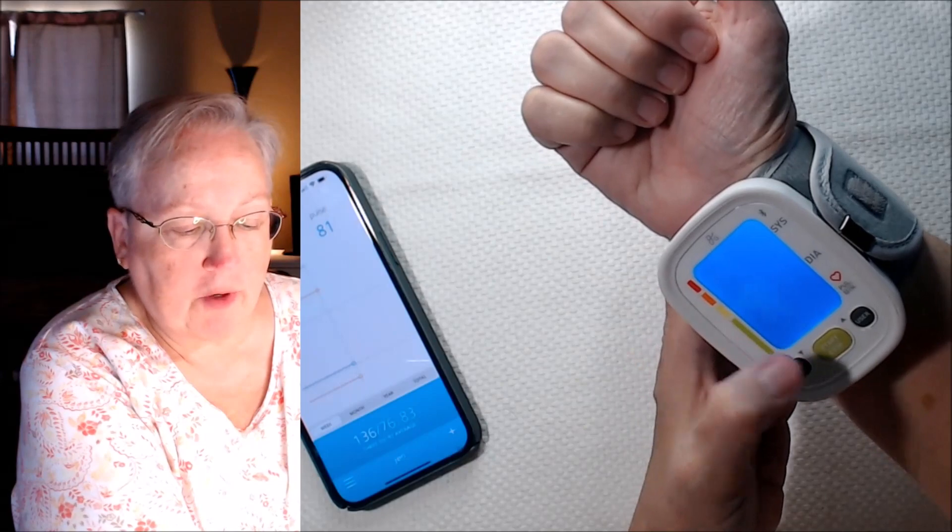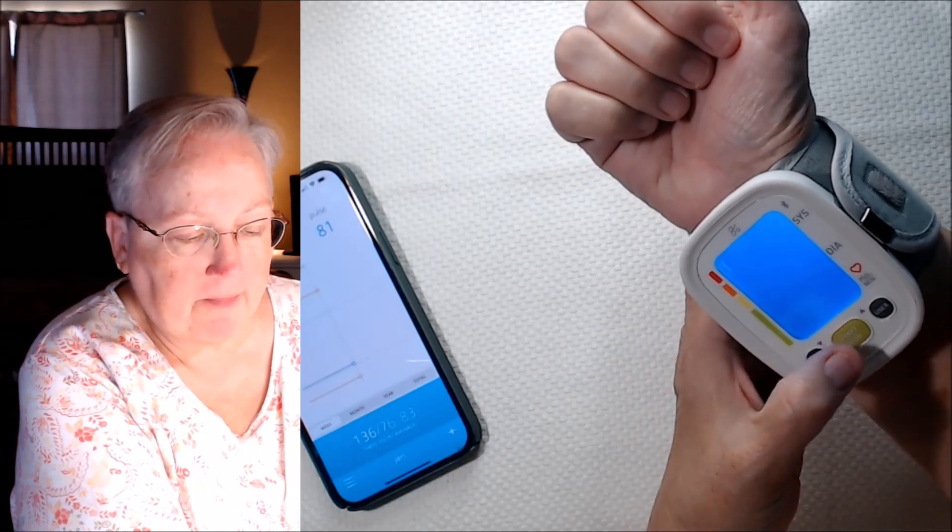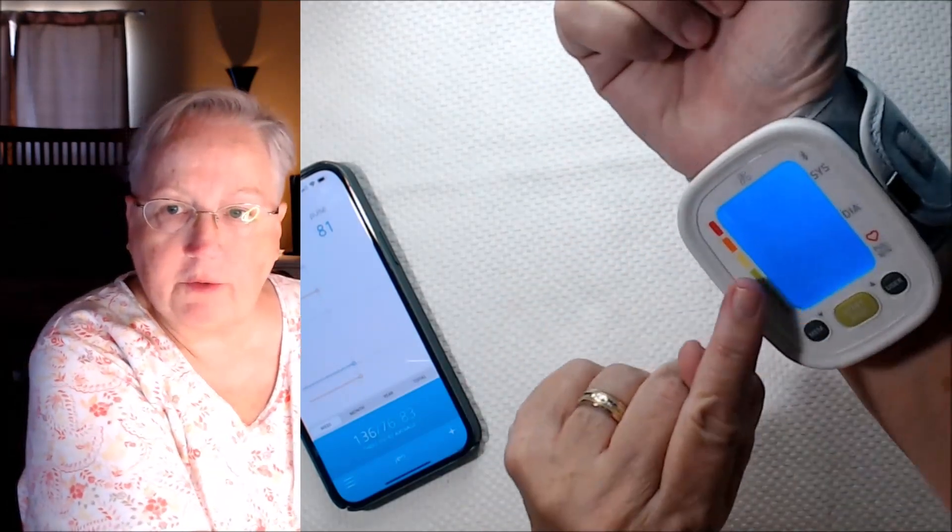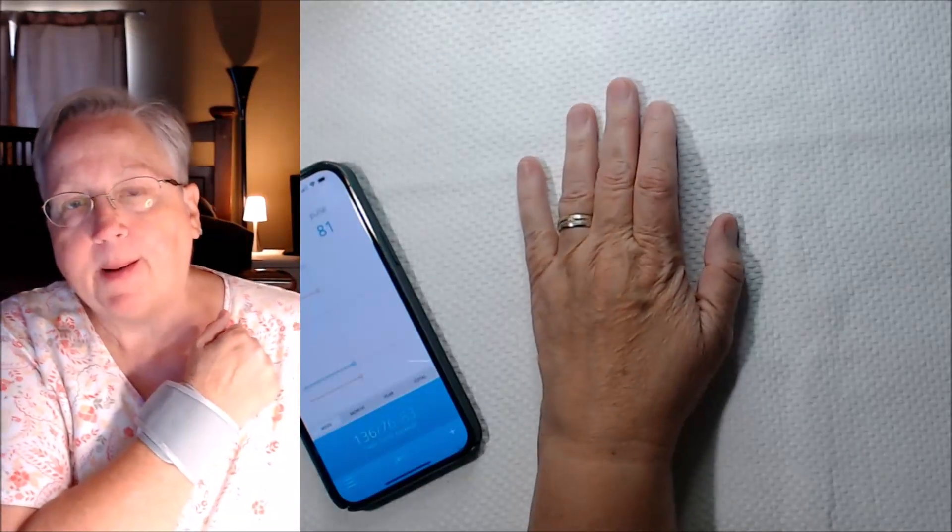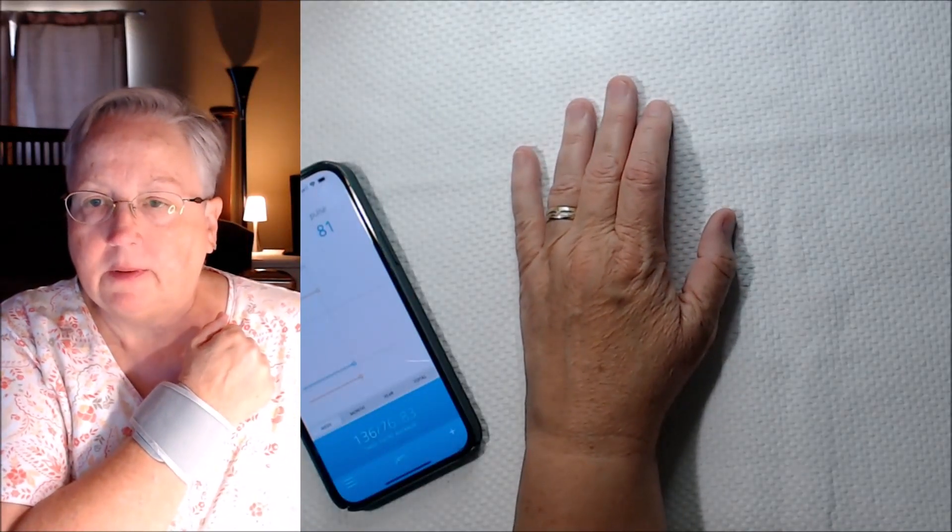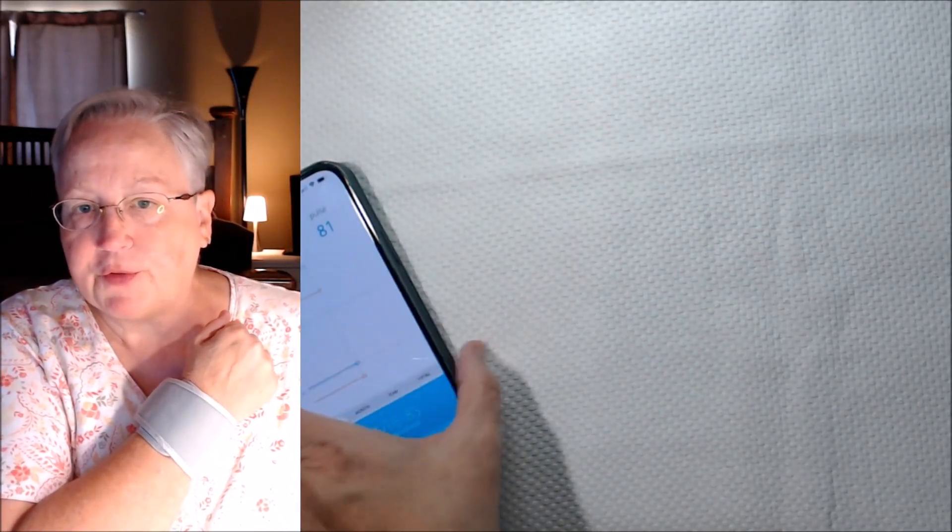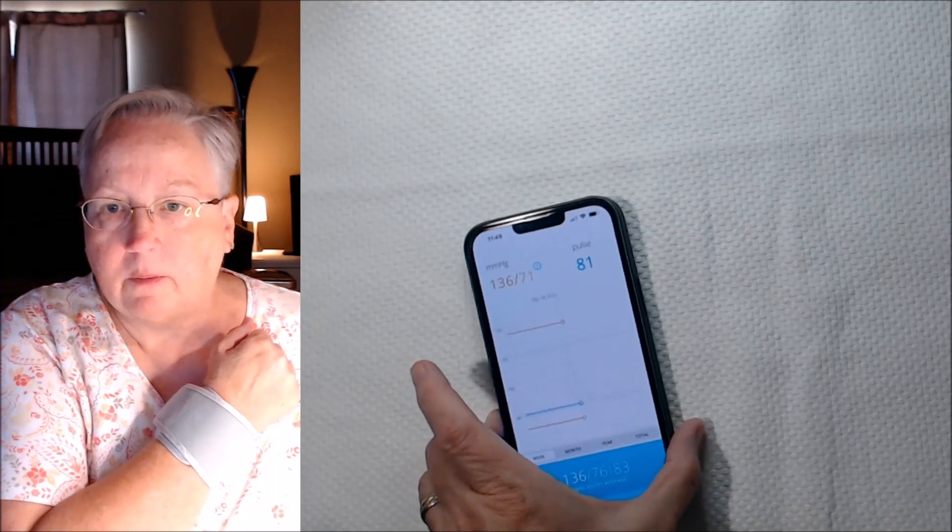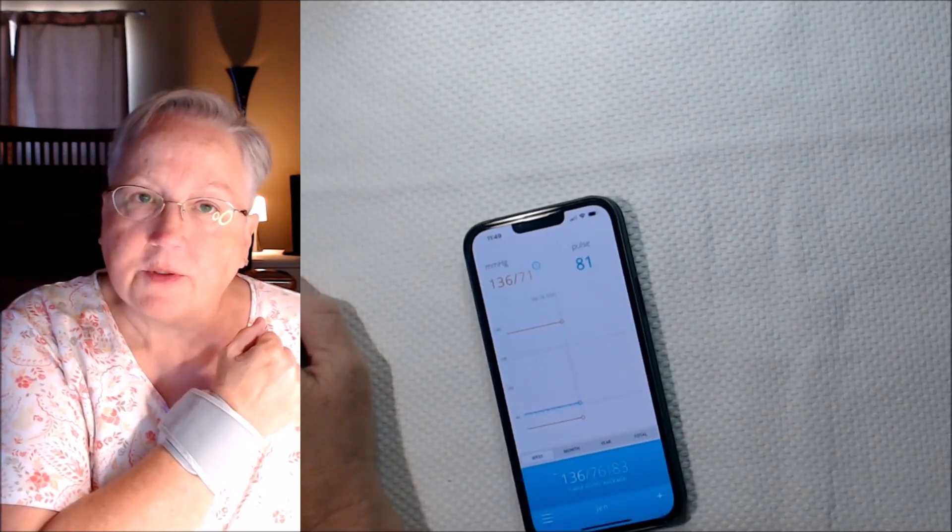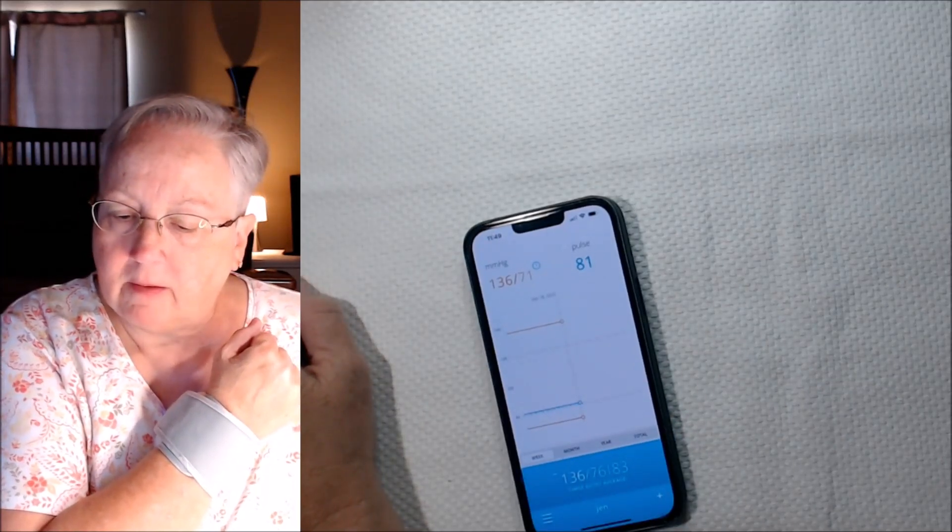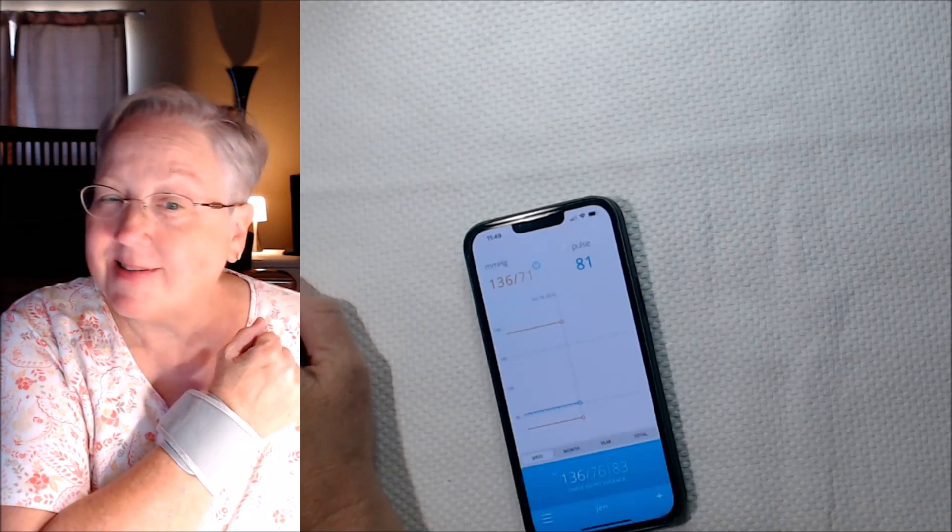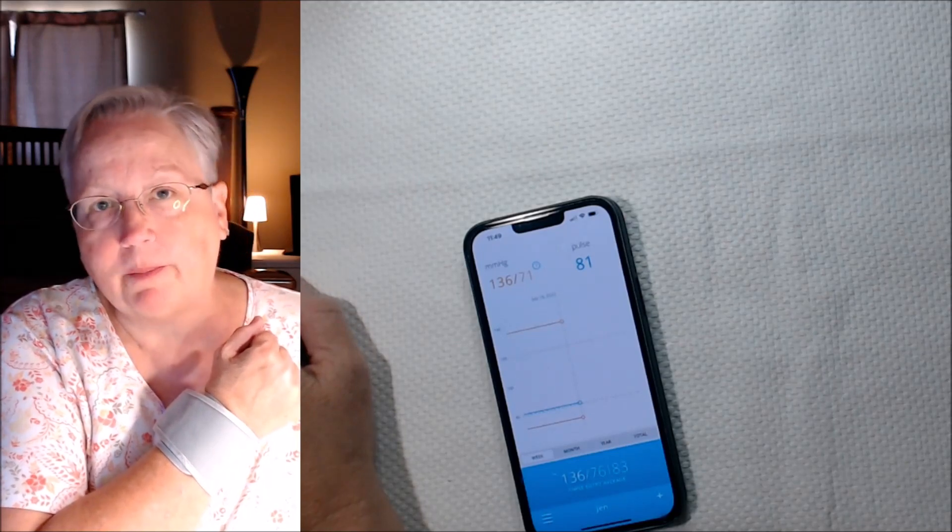User number two is me. It tells you a little dial that says put it up against your heart, and then it'll start up. So it's tightening. It doesn't take too long to do your blood pressure.